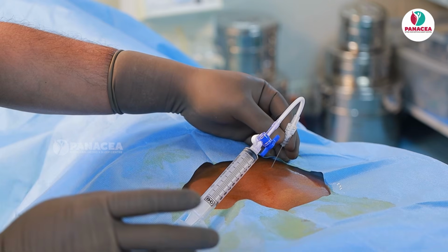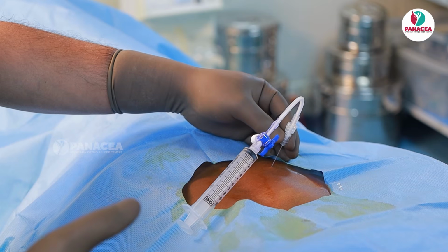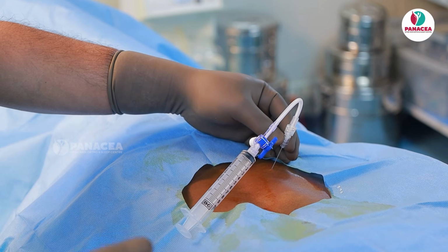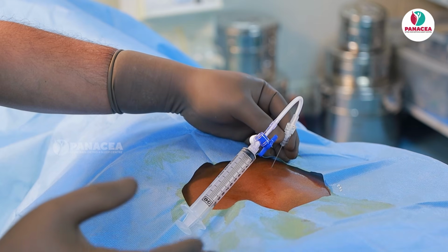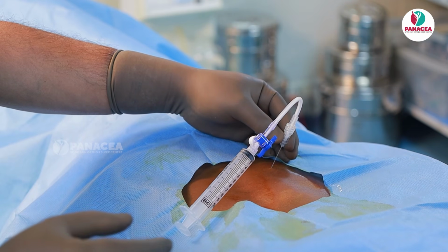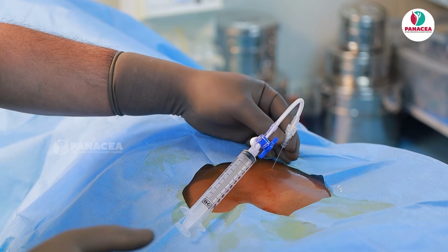A mixture of ropivacaine or bupivacaine 0.2%, which is a sensory dosage, along with either dexamethasone or methylprednisolone or triamcinolone. Below L3 it is fine, but above L3, you know about the artery of Adamkiewicz and all. So in case these particles go in and block the vessels, it can lead to anterior spinal artery syndrome, which is documented. So we should be very cautious.